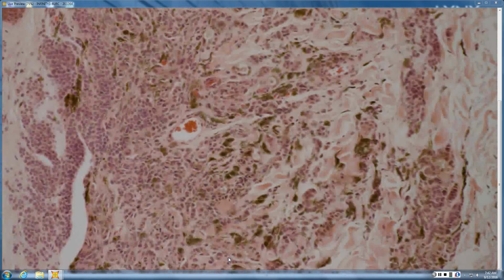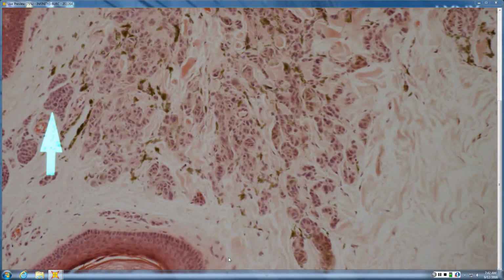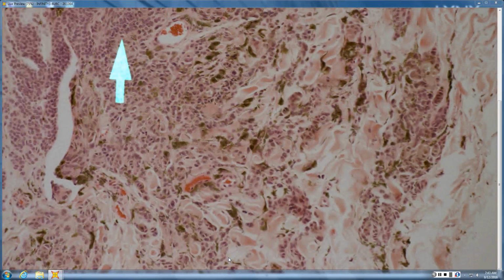So we've definitely got some sort of melanocytic proliferation in the dermis. There's some pigment scattered throughout. It doesn't quite look like it's maturing to me. When we look at it, I'm not sure that those cells are much larger than these cells, and it doesn't quite break up into single file. It does have a mix of dendritic melanocytes and non-dendritic melanocytes, which suggests that it may just be a combined nevus.